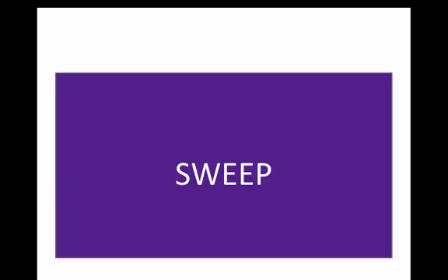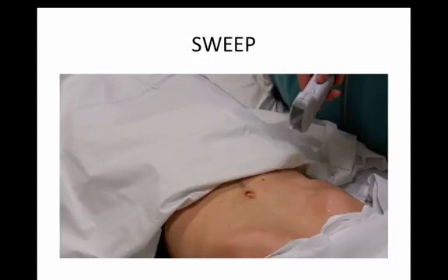Identifying the area of interest is the first step, but there is still work to do. You must actually sweep your probe through the heart. This is done by slowly flattening the probe until it is almost flat against the abdomen, then slowly coming back and increasing the angle of the probe relative to the abdomen until it is progressively more obtuse. Here is an example of a sweep.